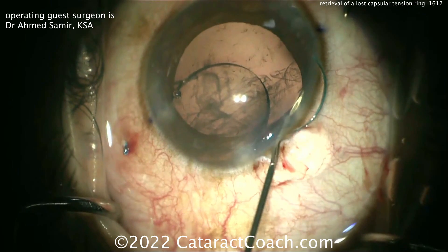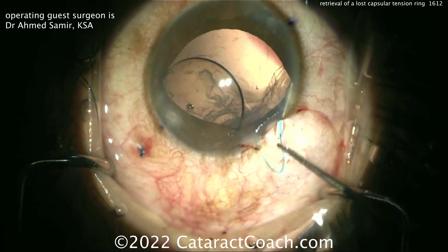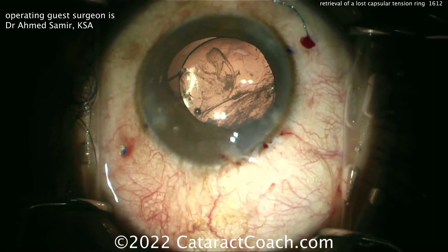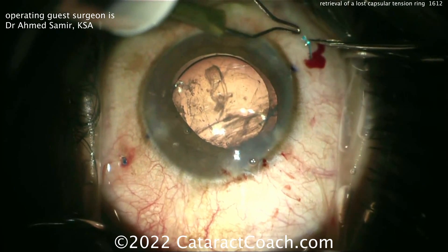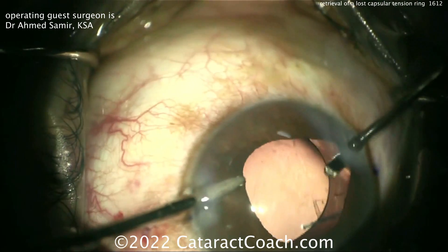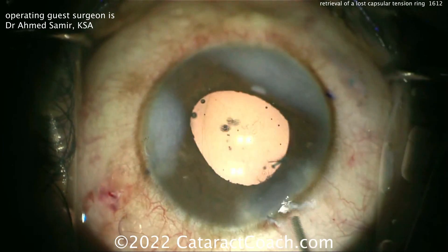What are the other options? You could put a capsular tension ring in — a Cionni ring, an Ahmed capsular tension segment — and use that to help hold the lens in place. Or you can do what you're seeing now, just do a straight Yamane technique. That's the choice here, and this patient is going to have a pretty good outcome. Very nice recovery. I've always thought about what would happen if I lost a CTR inside the eye — knock on wood, it's never happened to me. But this video is very helpful because it shows us how we can use a gonio prism to visualize the issue and find that lost CTR.